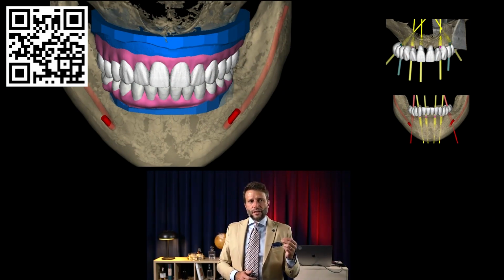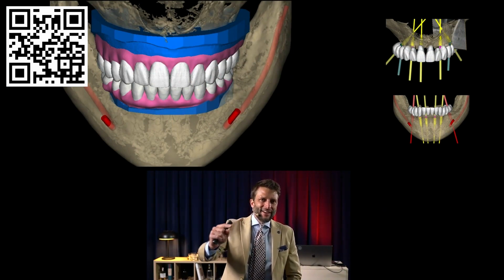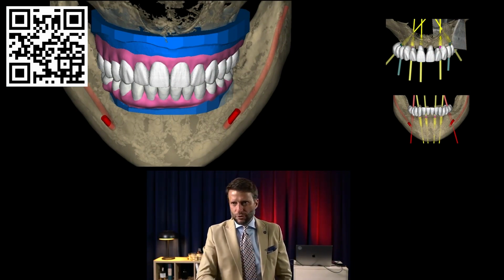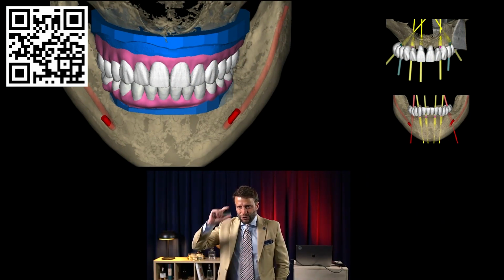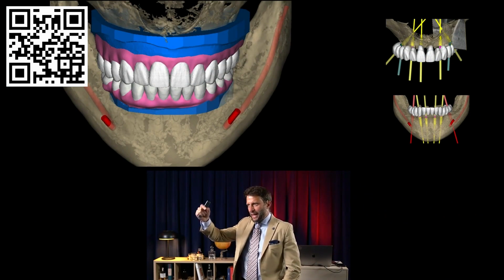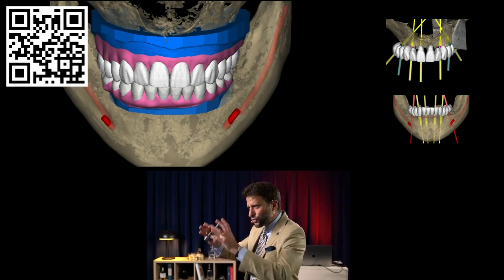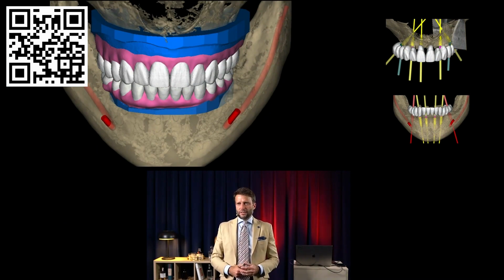Now, let me ask you something. How could you forecast all these things that I just shared with you in the last 3 minutes without 3D technology? Hard, huh? To visualize, to sequence, to compare, to plan, to design, to integrate the surgery, biology, function, and aesthetics all together and be able to have a clear vision. And once you go to the surgery, you know exactly what is going to happen and why it's going to happen.